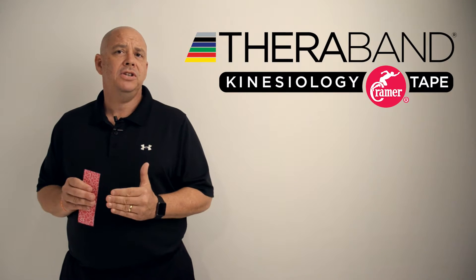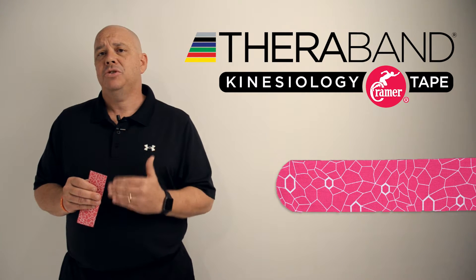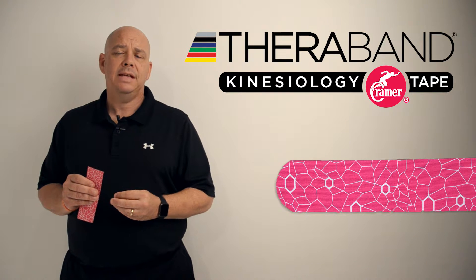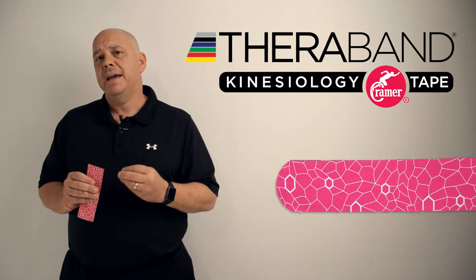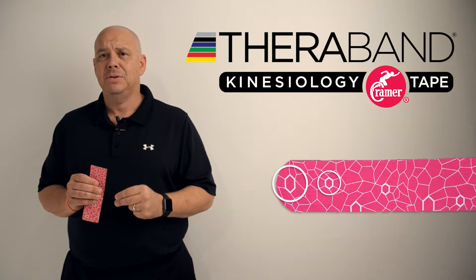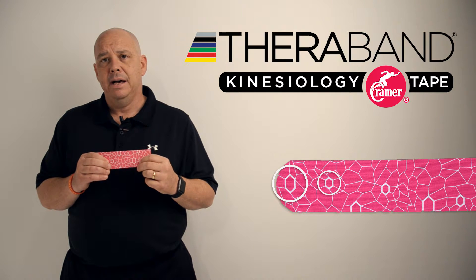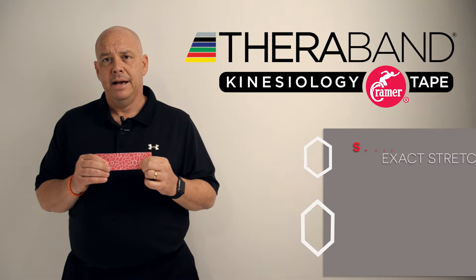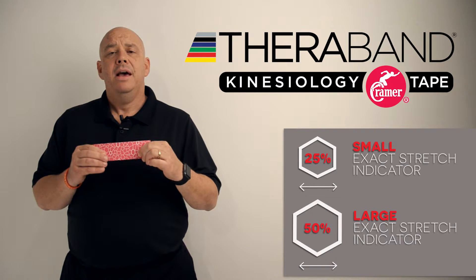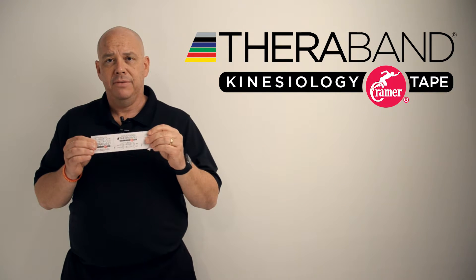First of all, the most important differentiating feature of this tape is going to be the exact stretch indicators. The exact stretch indicators tell us exactly how much tension we're able to put on our kinesiology tape when we apply it to the skin. Within the TheraBand kinesiology tape exact stretch indicators, we have a 25% and a 50% stretch indicator. The small hexagon when stretched becomes an equal-sided hexagon at 25% tension. The larger hexagon when stretched becomes an equal-sided hexagon at 50% stretch, and that's easily referenced on the back of the tape.